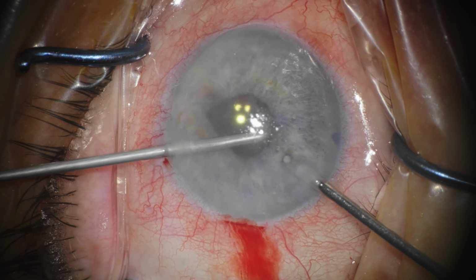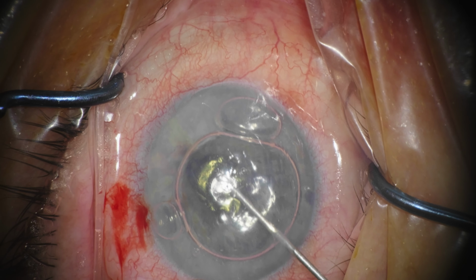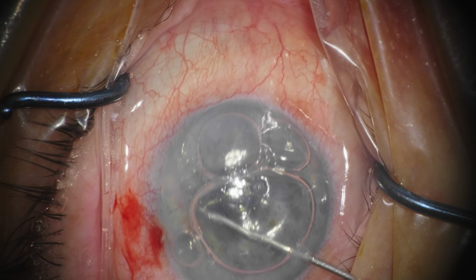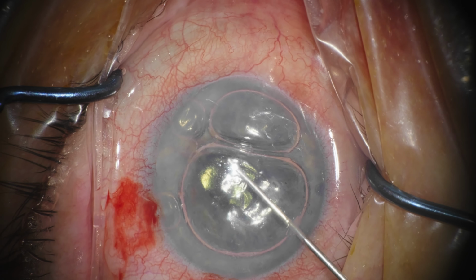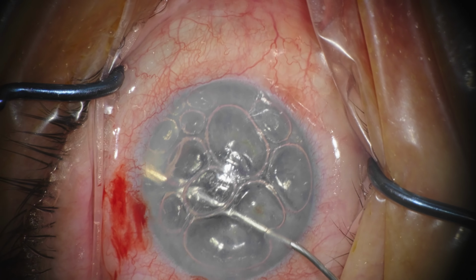We do the inferior PI, we check it with the vitrector behind the pupil, and then we lyse the anterior synechia and inject the air bubble to start our descemetorhexis.